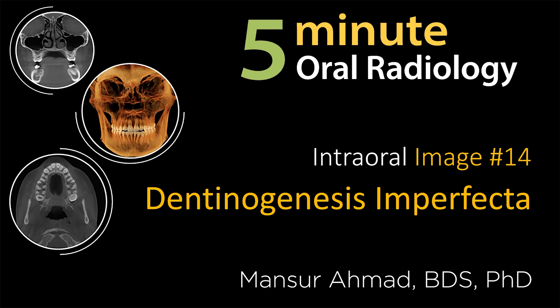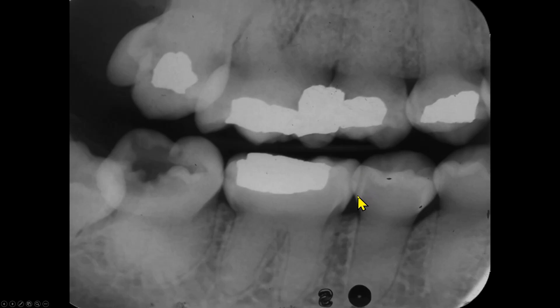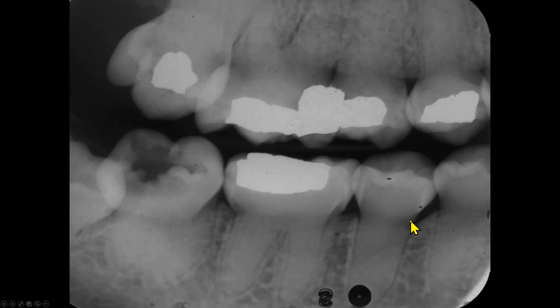We have one bitewing radiograph to discuss. On this bitewing radiograph, we see multiple teeth with metallic restorations. Unlike the radiograph with amelogenesis imperfecta that we saw on a different video, this radiograph shows a distinct difference between the dentin and enamel layer. The cusps are not pointed. The crown is normal, and the cervical area is narrow. There are no distinct signs of pulp chamber or pulp canals.